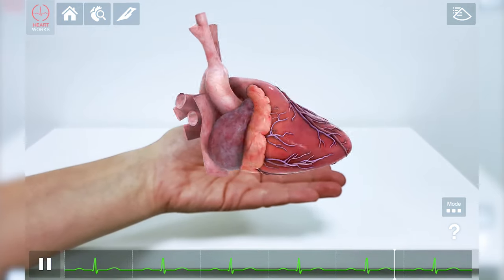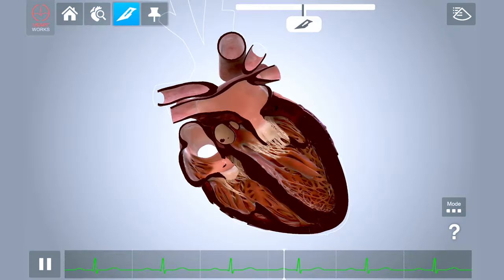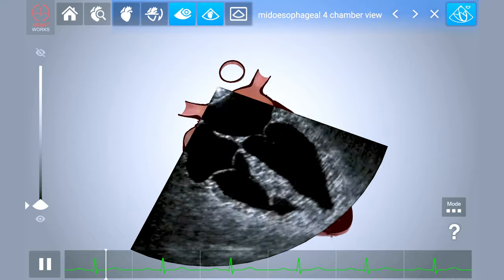You can hold a fully interactive and accurate 3D heart in your hands, label structures, slice in any plane, and overlay transesophageal and transthoracic ultrasound views.